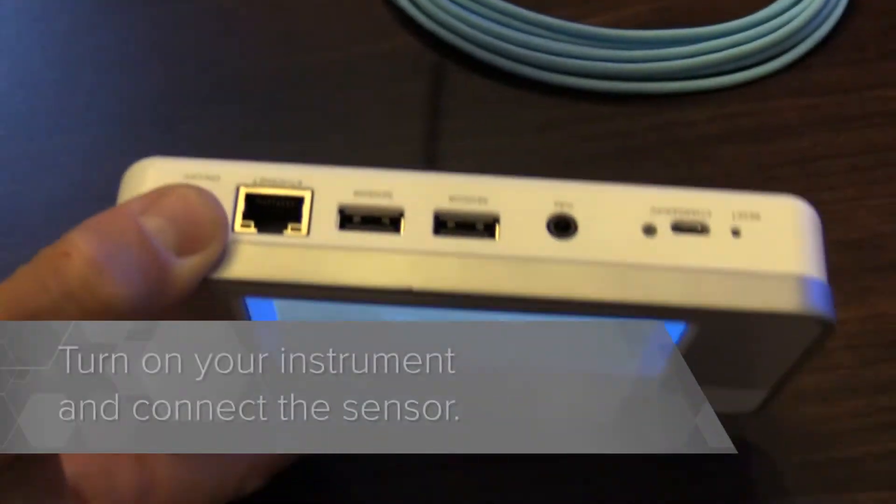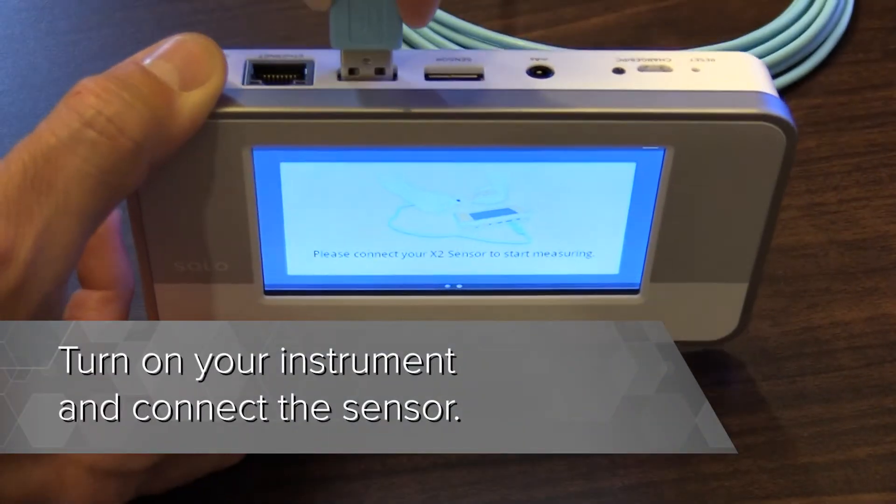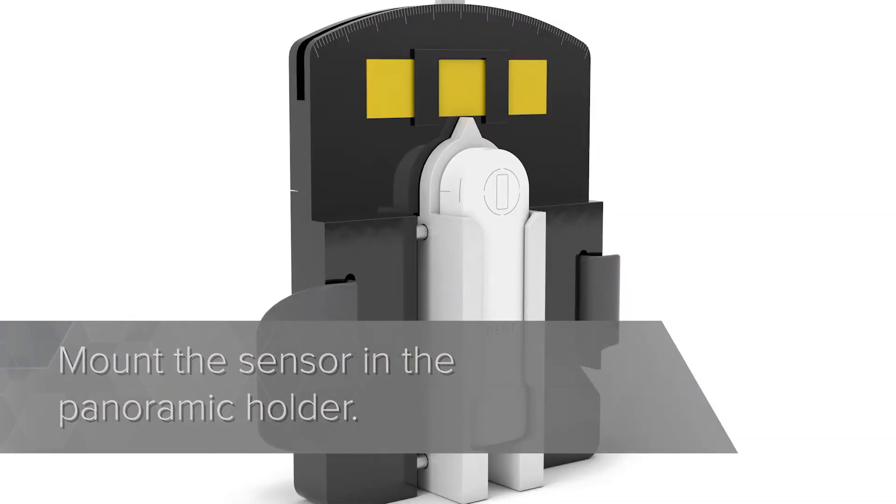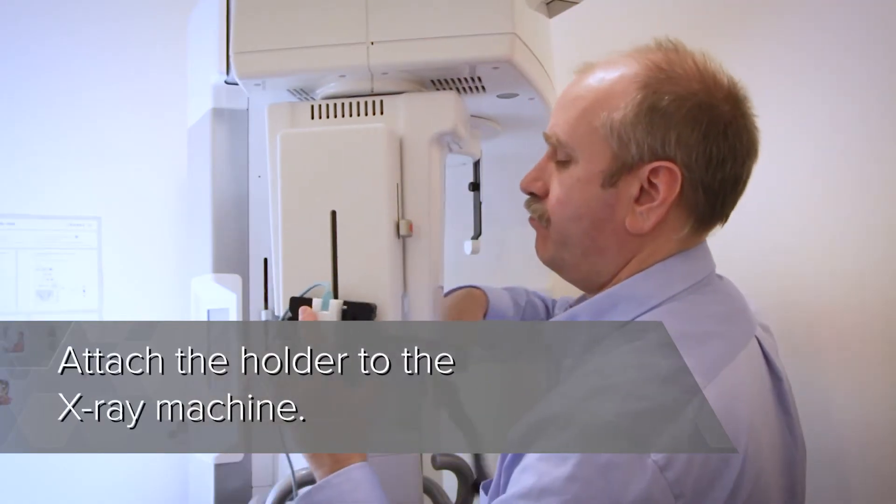Turn on the instrument and connect the sensor. Mount the sensor in the panoramic holder. Attach the holder to the X-ray machine.